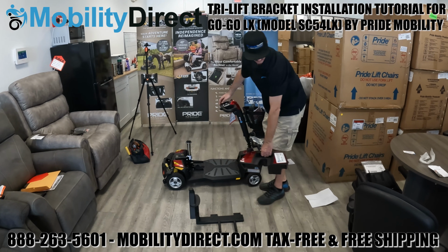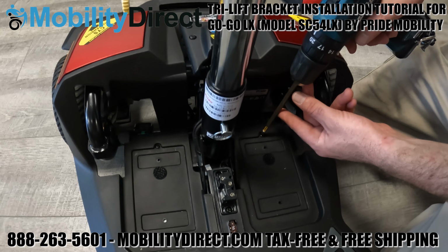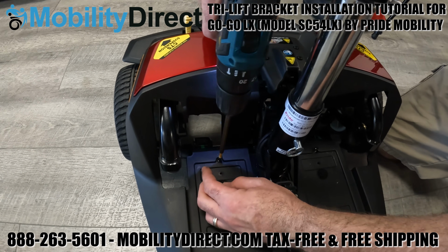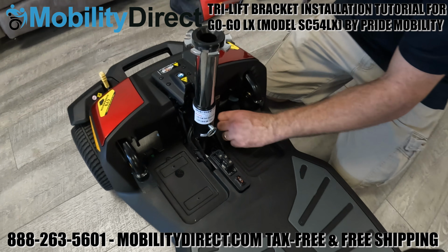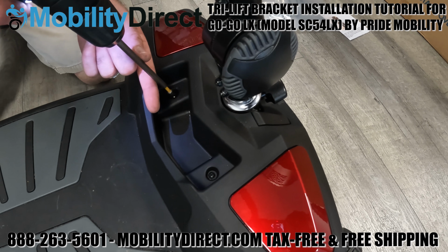First, all you have to do is remove the seat and then remove the battery box. And then unscrewing the two screws with a Phillips head screwdriver or a drill. We're taking out the first two screws that secure the rear side of the floorboard, which is one big piece. And what we're doing is we're actually just going to take out the front two screws as well that we're pointing out. Make sure you keep them handy and don't lose them.